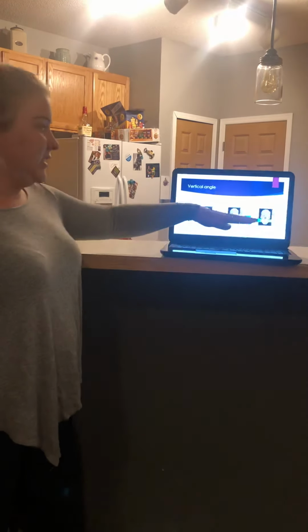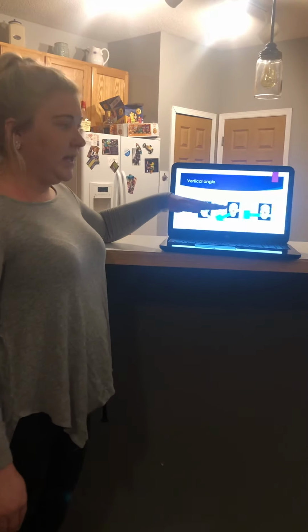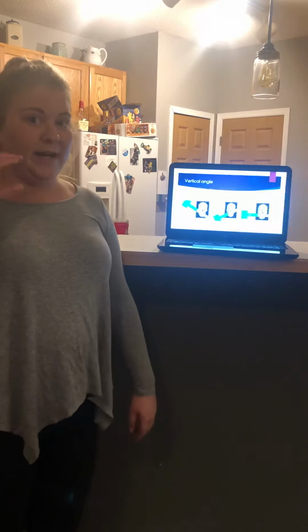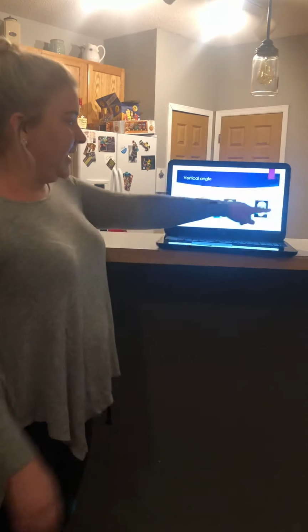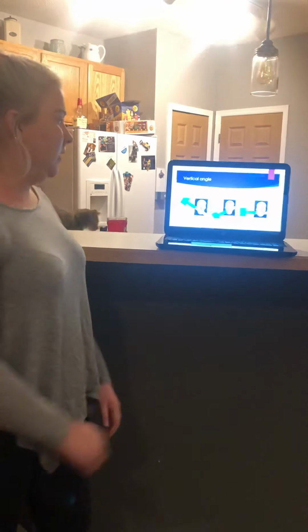And then this is going to be a 0 vertical angle, and that is holding the PID directly parallel with the floor, directly right at the patient's arch. So in that case, we would get our bite wings holding at a 0 vertical angle.